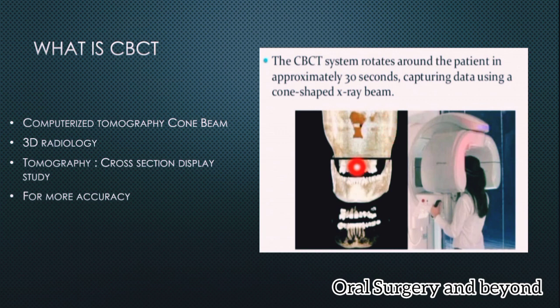The computer also does 3D reconstruction for a more accurate view for treatment planning, right? It is basically 3D radiology. As I said, it is a cross-sectional display of the study and it is done for more accurate diagnosis of a particular area.